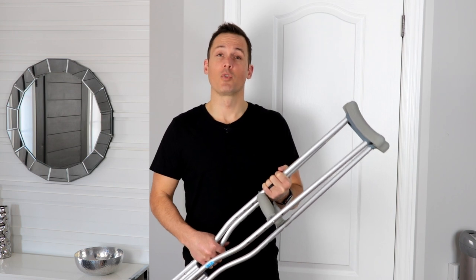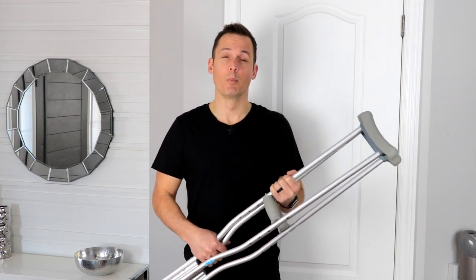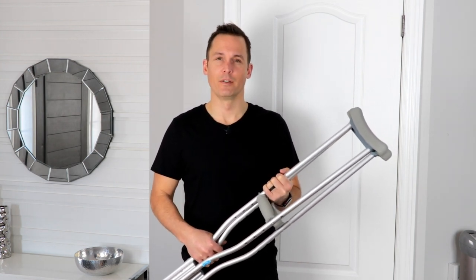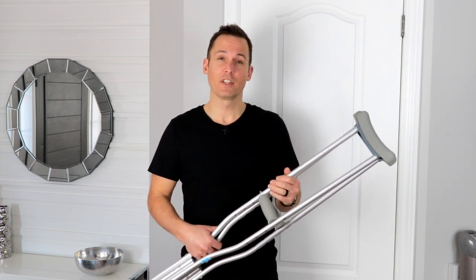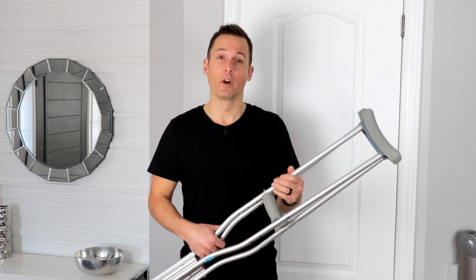Ensuring you know how to use crutches properly before your surgery will make the transition home easier. Today we're going to cover the use of crutches on flat ground, while climbing stairs, and the use of one crutch.